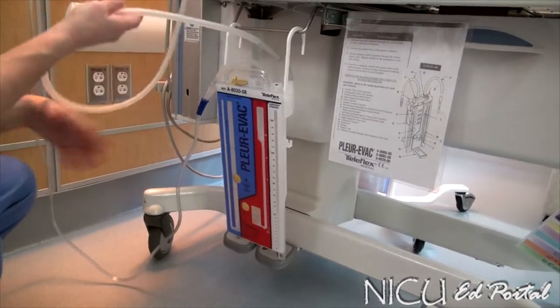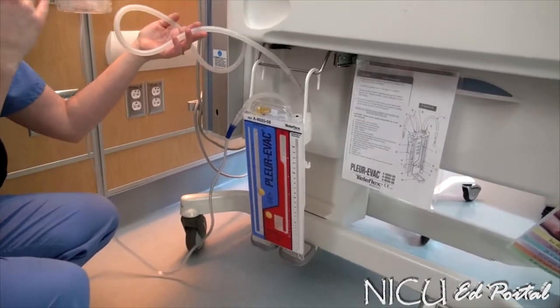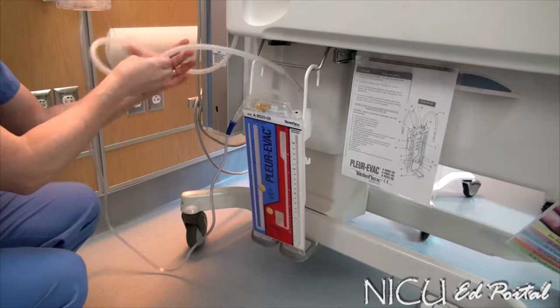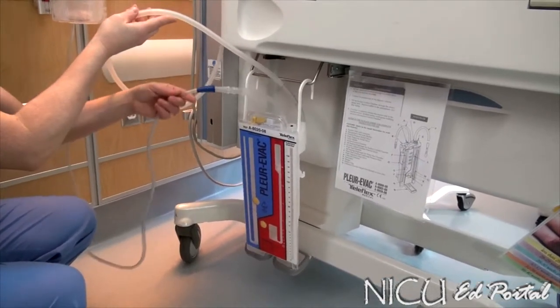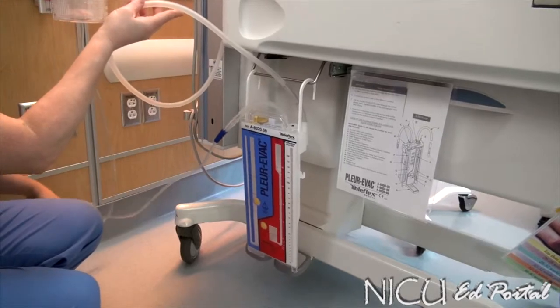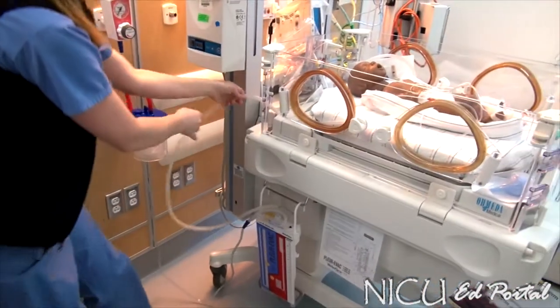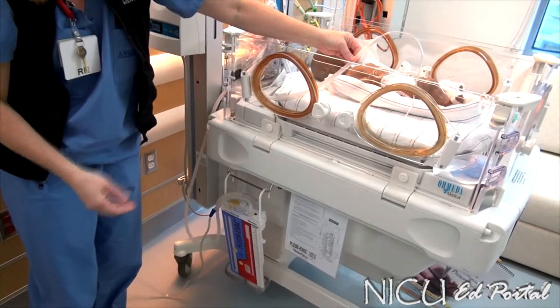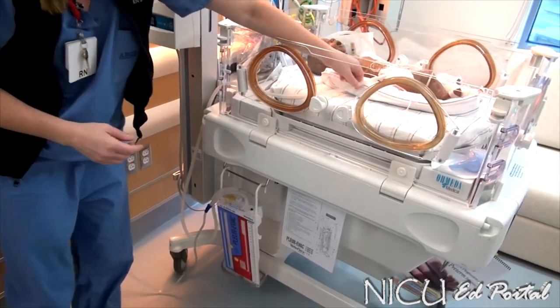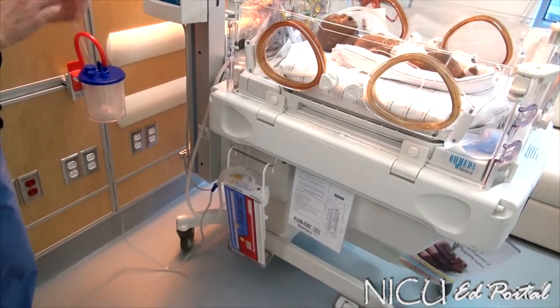The ports to this are labeled for teaching purposes, but when you open up your package, it's not labeled. This port here is what goes to the wall suction. This port is what goes to the baby and connects right to the chest tube. Those are really the two ports that you need to make sure go to the right connections.